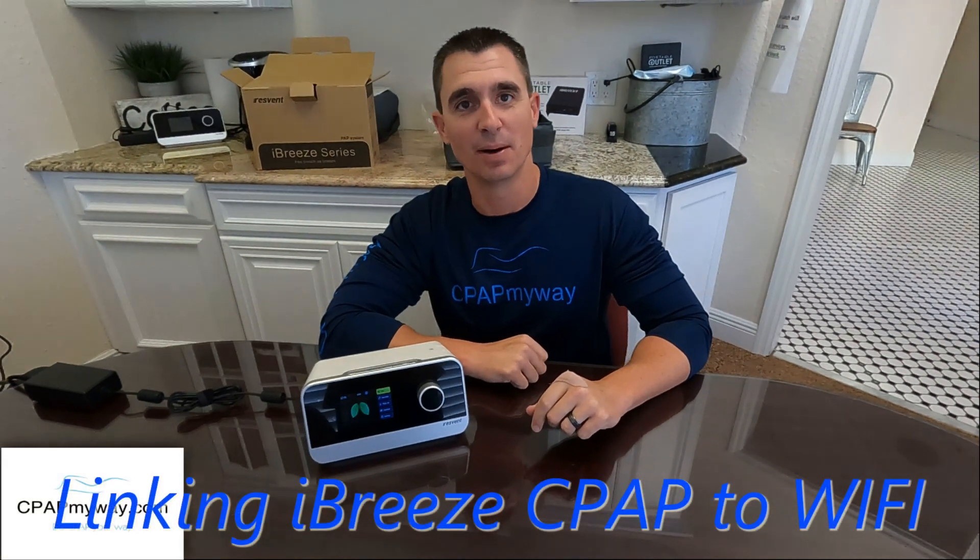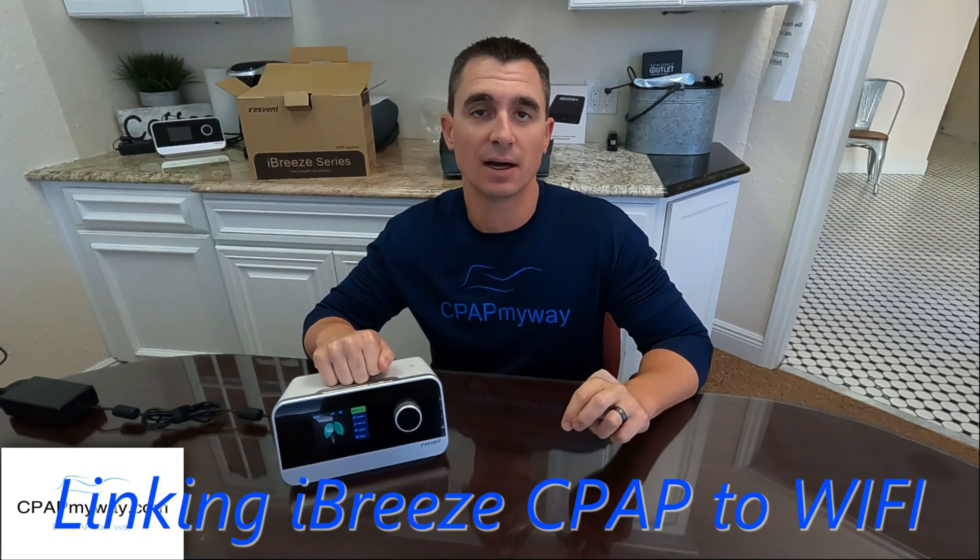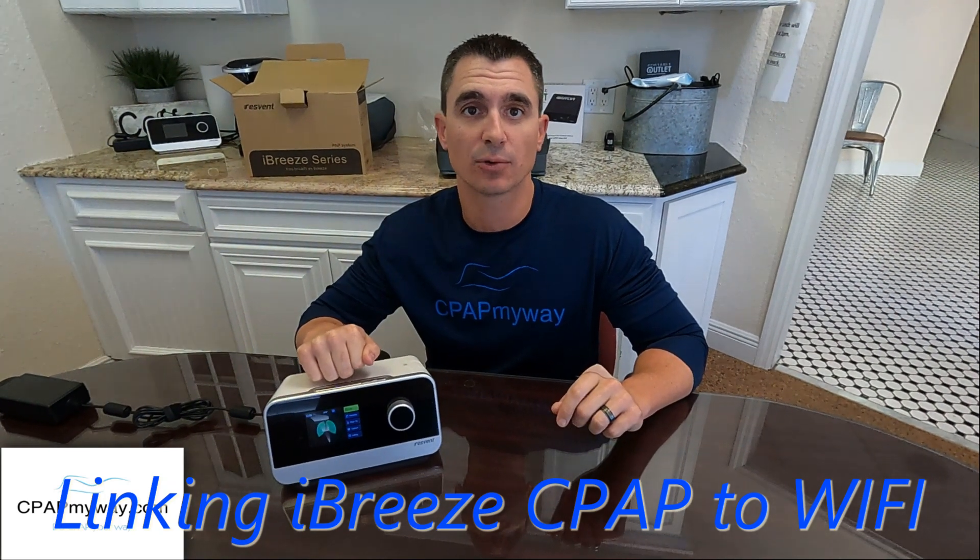Hey, it's Clay, CPAP MyWay, CPAPMyWay.com. Wanted to do a quick tutorial for you on how to set up your Wi-Fi for your iBreeze.